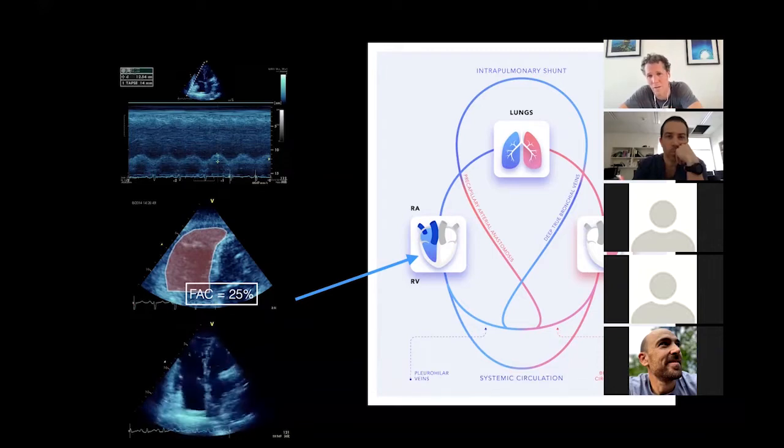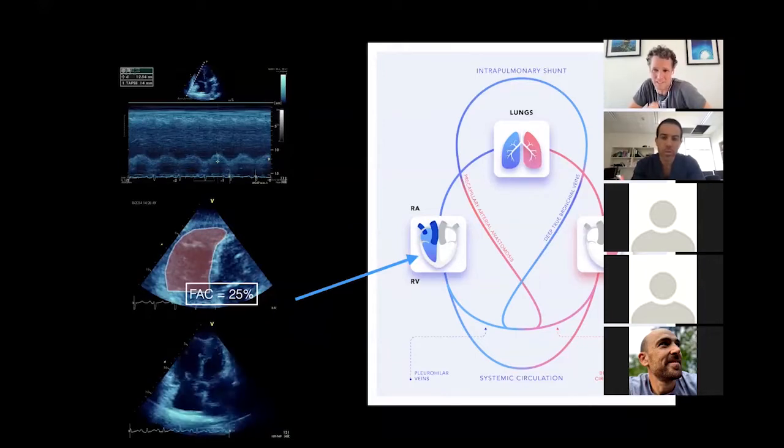When you were talking about LV diastolic function and looking for a normal left atrial pressure, you've got to start with the simple things first. If you're talking about the B bump and the L wave before you've mentioned the E/A ratio, E prime, left atrial size and the 2D assessment, you're at the risk of the examiner raising eyebrows and waiting. So start with the simple things first. I think the icing on the cake is talking about the B bump and L wave, but just don't go for that first. Talk to them about the basic things first. This exam is all about just doing the basic things well.